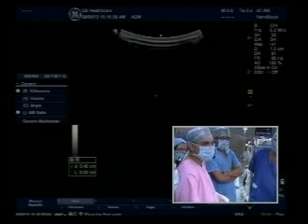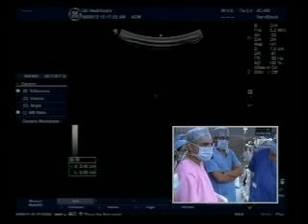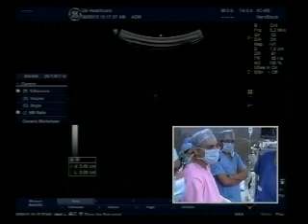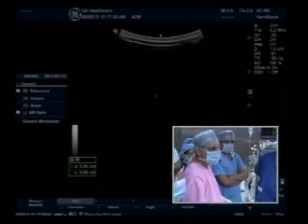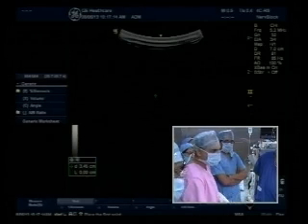I have a question. Here you are judging the depth perpendicular to the skin. But when you are doing an epidural puncture, you are often oblique. So that also you must be taking into account, isn't it? Well, you are obviously estimating the depth in the beam of the ultrasound, which in this case was in the midline.